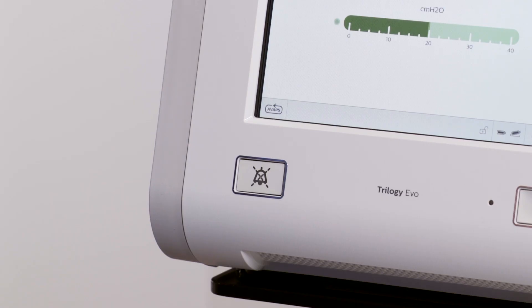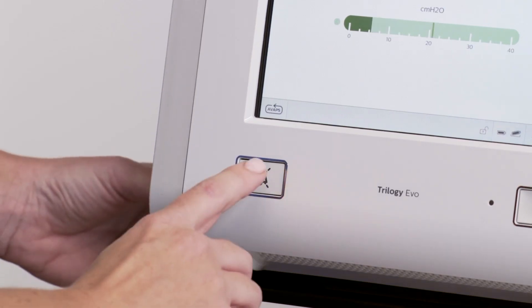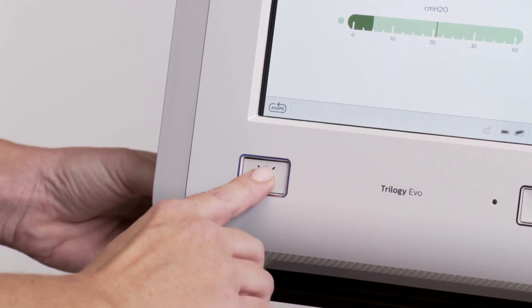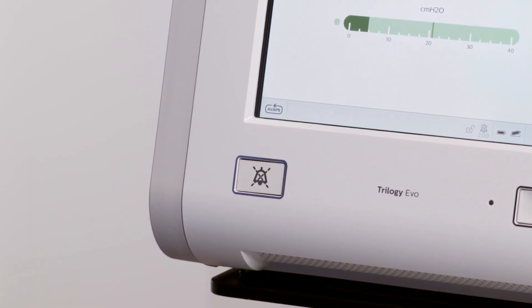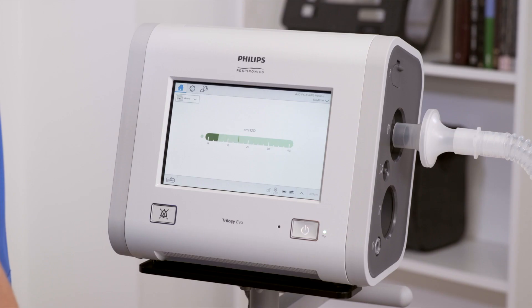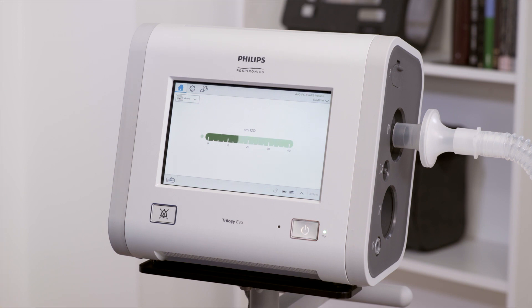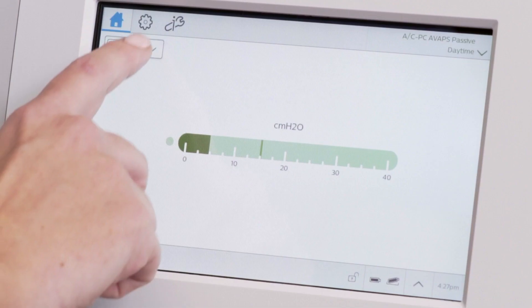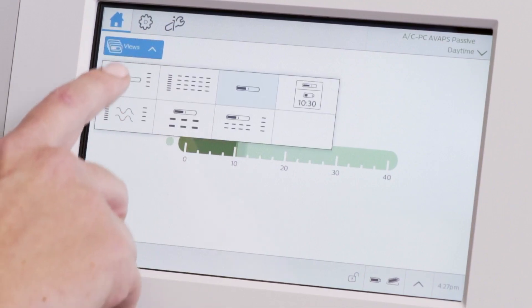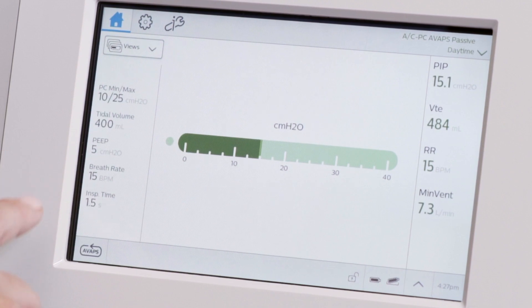There is also an Alarm Silence button to mute audible alarms for two minutes. A variety of monitoring views are available. Some offer more details than others, depending on whether you are in full or limited access.